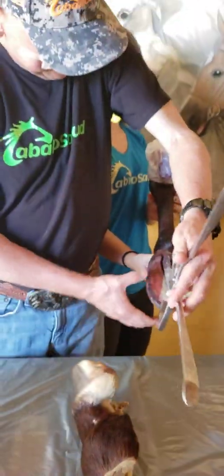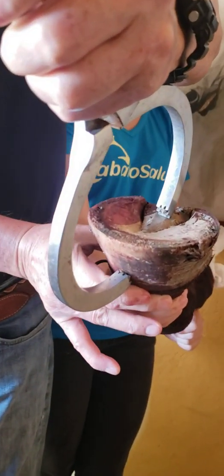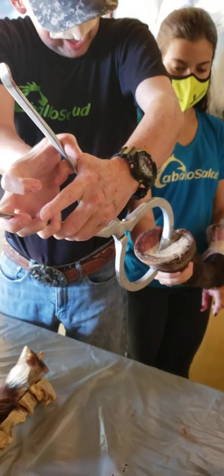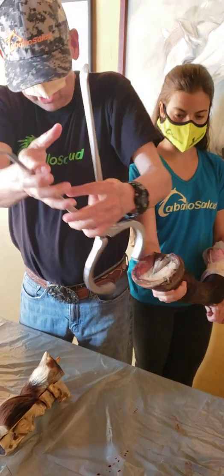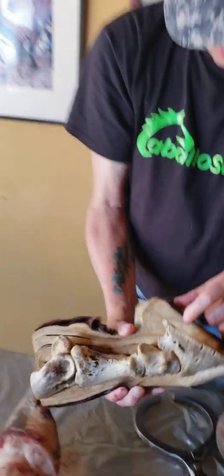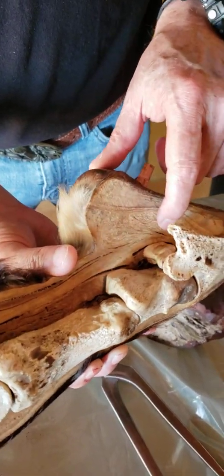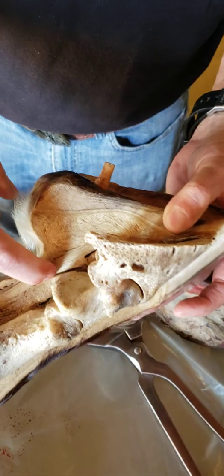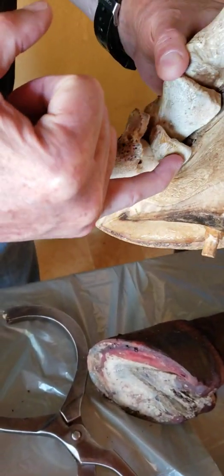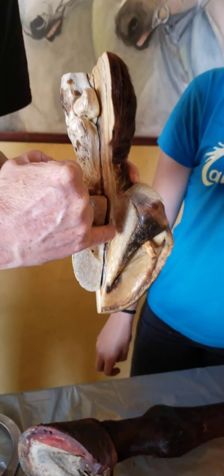Then finally, in the middle third and in the lower part of the hoof bone, I will make pressure in the front, and I will be making pressure on the deep digital flexor tendon. I'm also going to be pressuring the digital cushion. I'm also going to be making pressure on the deep digital flexor tendon, and then finally I'm going to be making pressure on the synovial bursa of the navicular bone, and then the navicular bone itself.